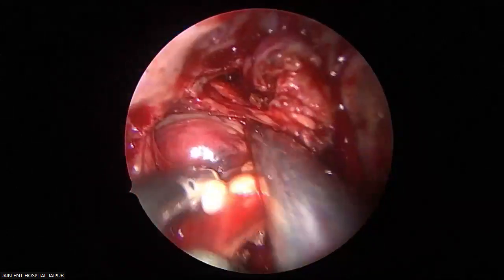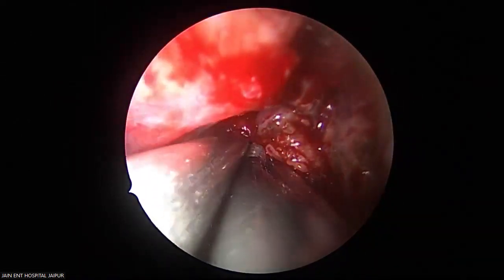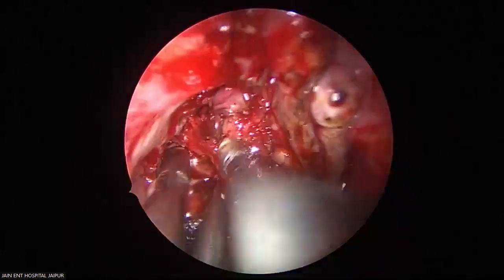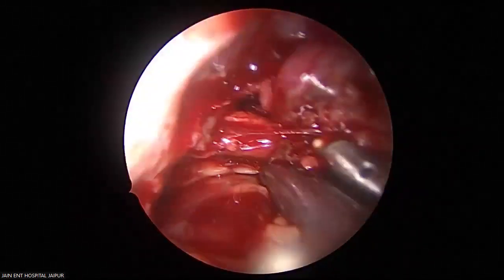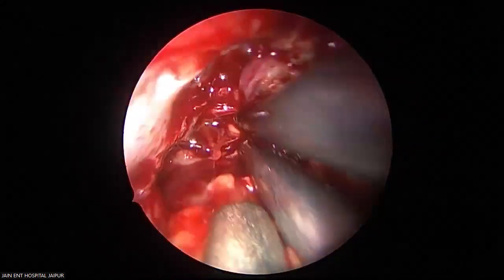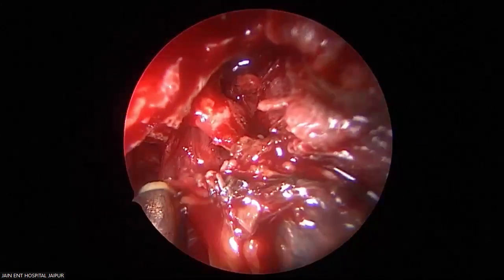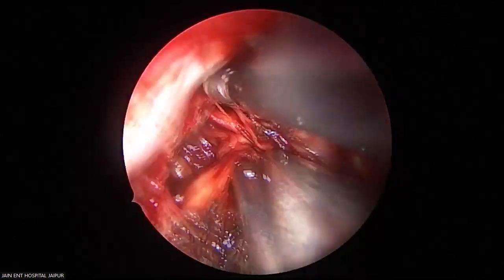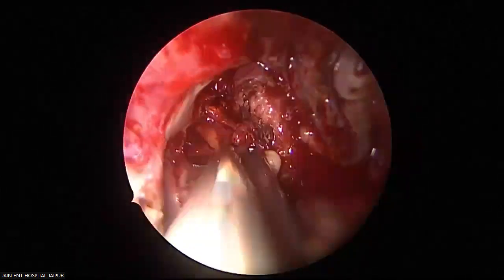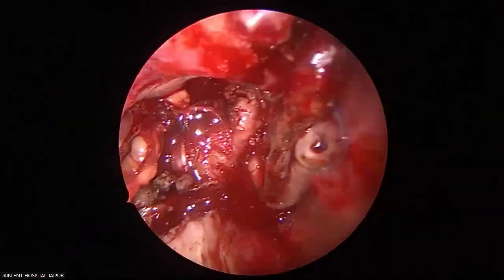This window, and we can see the tumor surface everywhere. And a gentle pulling will not tear it off. So one or two branches we have already coagulated, cut. All this is tumor surface, very nicely accessible. Give me a gauze piece. See, to orient you with the infratemporal fossa.